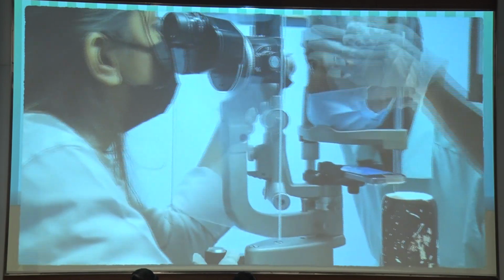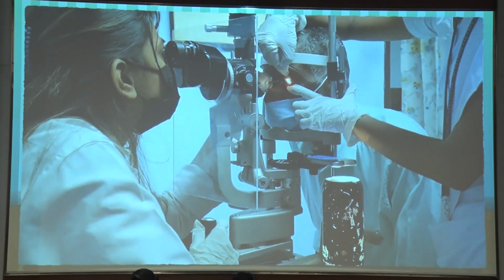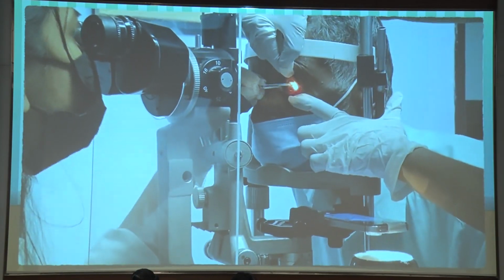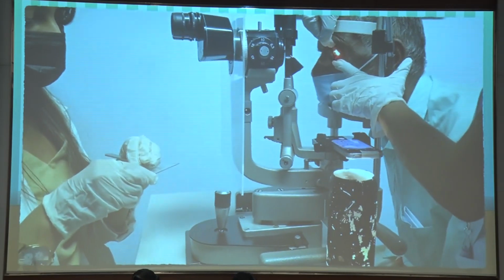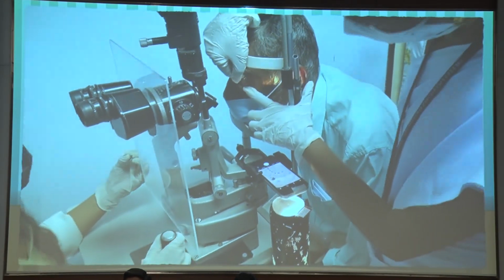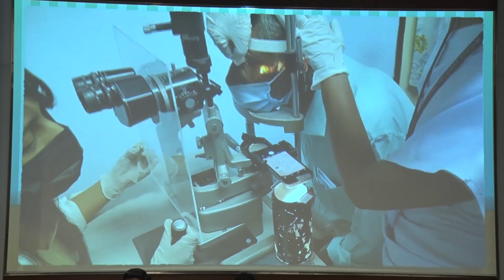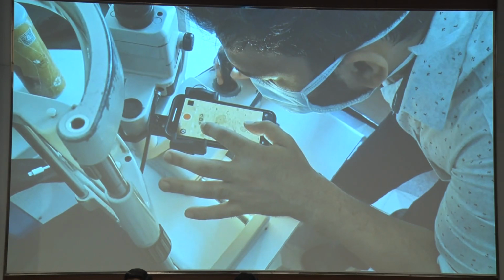This video shows the application of SLIM in a patient with corneal fungal ulcer. The doctor can be seen doing on-spot diagnosis of the corneal scraping using the smartphone-based IOLscope and accordingly giving the appropriate treatment, which results in better patient counseling, faster treatment, and prevents delay of diagnosis.